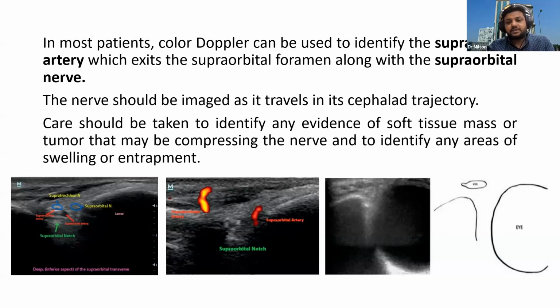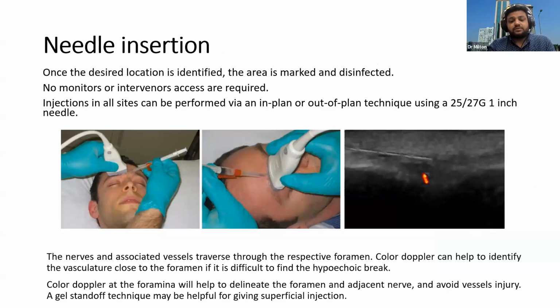After a successful diagnostic block, you can also do radio frequency here. Since it is sensory, you can do conventional radio frequency here. You can also do cryo. Most probably in our center they also did cryo here, I saw it on Facebook. So you can do these three things.